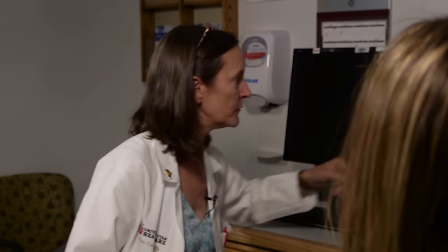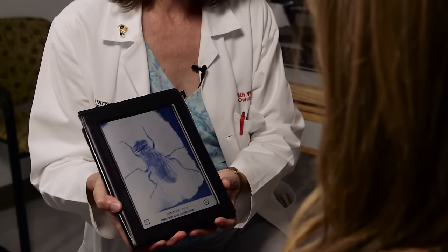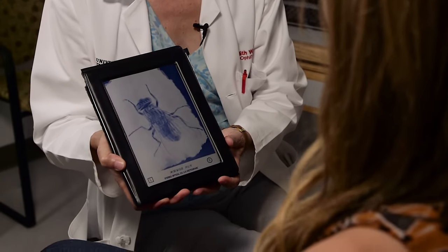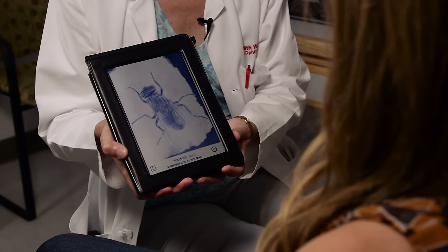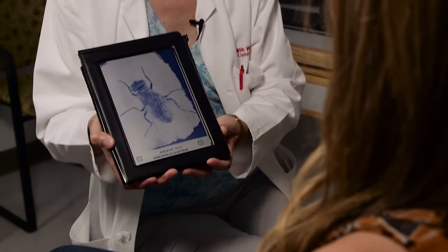Once you've checked color vision, we routinely check stereopsis. For that you need these special polarized glasses — they can be used for other interesting purposes as well. You ask the patient whether they can see the fly as three-dimensional, and I ask: can you pinch the wing of the fly? That's a classic answer. Then there's a little more detailed testing — that's gross stereopsis, this is a little more detailed.